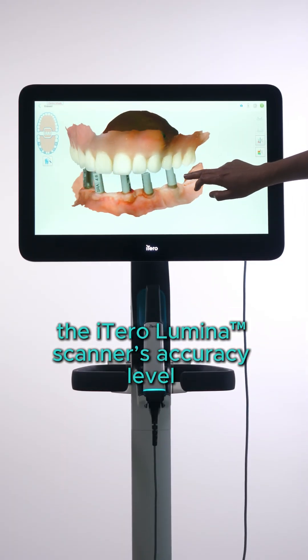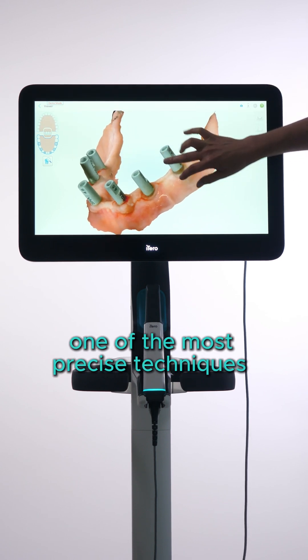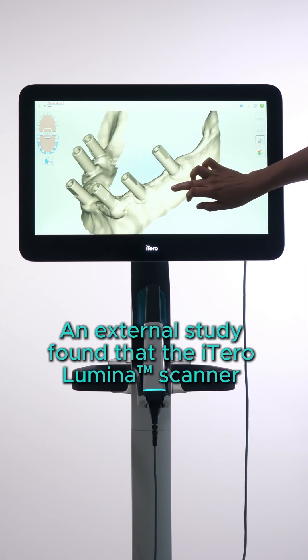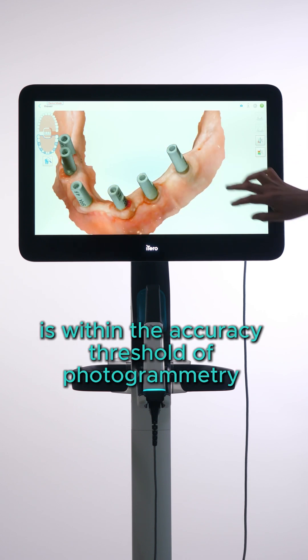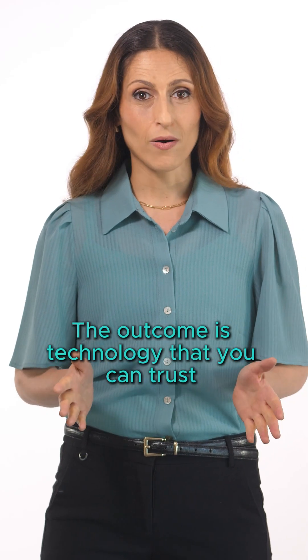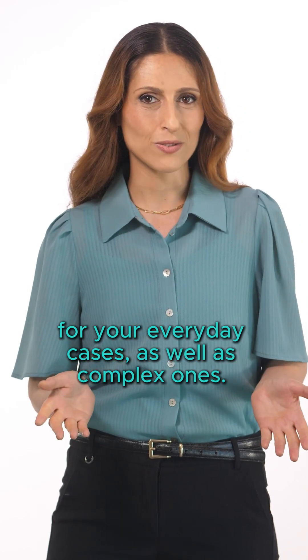The iTero Lumina scanner's accuracy level has been pressure tested against one of the most precise techniques for dental accuracy — photogrammetry. An external study found that the iTero Lumina scanner is within the accuracy threshold of photogrammetry for full arch implant restorations. The outcome is technology that you can trust for your everyday cases as well as complex ones.